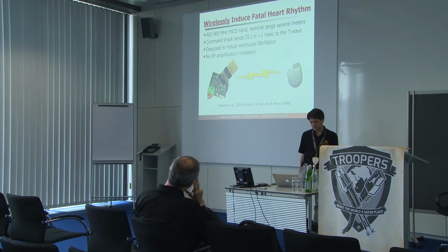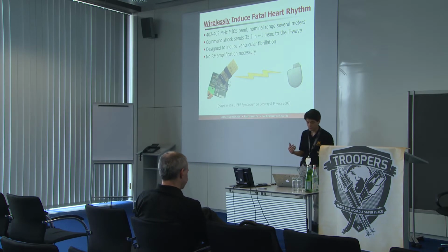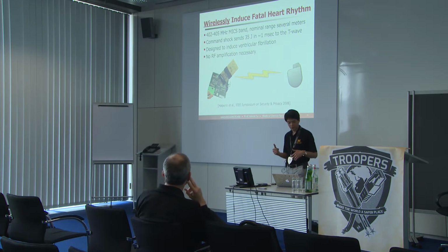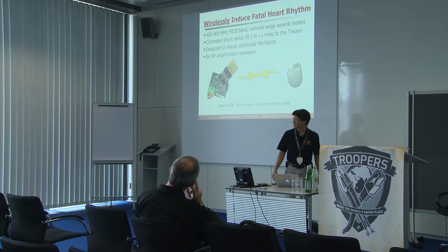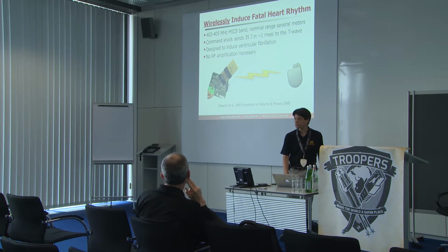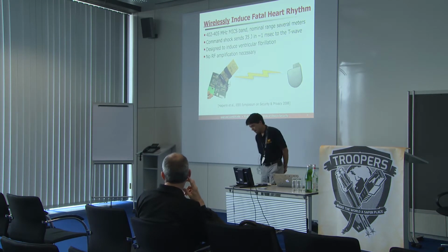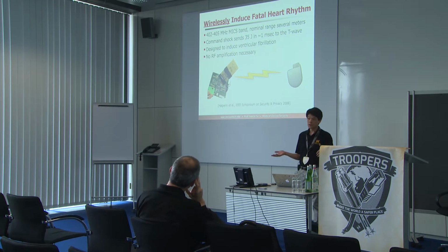Some students at MIT recently recreated this on a more modern band. We did it on the inductive coupling interface, which was in the kilohertz range. The MIT folks did it in the 400 megahertz range, so that's far field. You're talking several meters. I believe that's on the order of like 10 or 14 meters or so that they were able to get. Kill switch, literally. Kill switch. Well, but you got to keep in mind though, they are having to balance security and safety. They could have done better, but this is worth a side note.